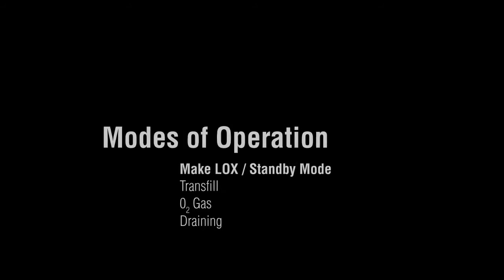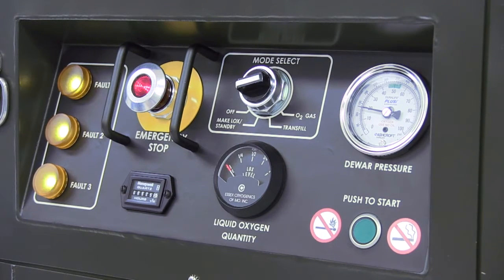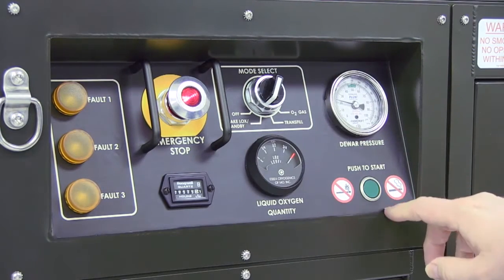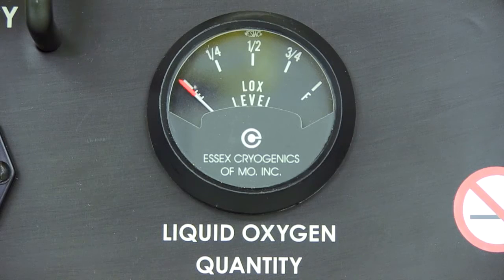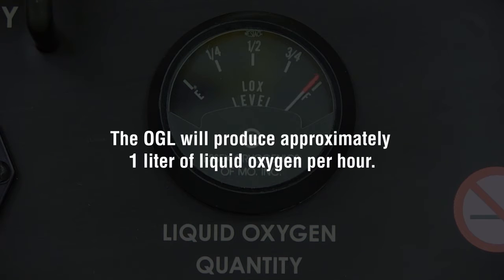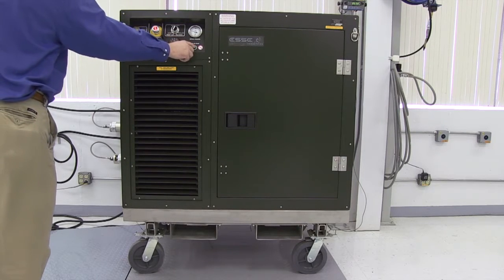To make LOX, make sure power is connected to the OGL and the emergency stop light on the control panel is illuminated. Turn the mode selector switch on the control panel to make LOX standby. Press and release the green push-to-start button. If the system is starting from an empty state with no LOX, it will take two to three hours for LOX to start accumulating in the dewar. The OGL will produce approximately one liter of liquid oxygen per hour. Allow at least 40 hours to completely fill the dewar.